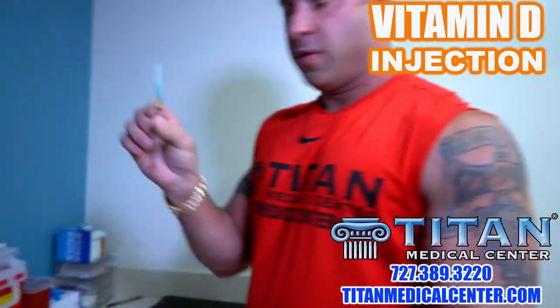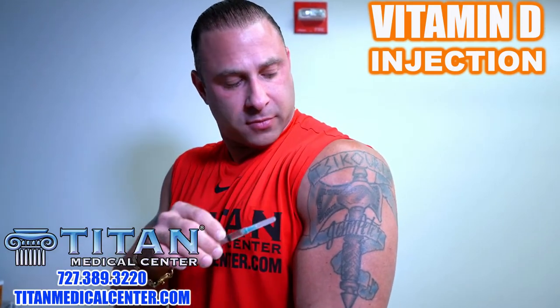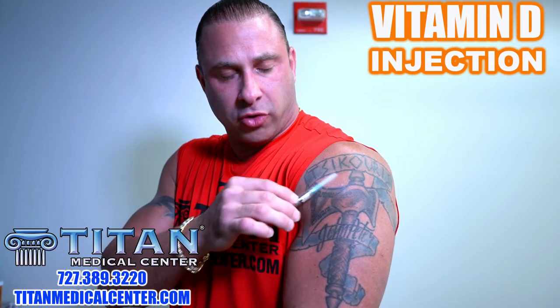Alright, vitamin D is ready to go. Now, where are we going to do the injection? Vitamin D is like any other injection — you can do it intramuscularly in any muscle. I'm going to hit right here in the shoulder, the center of the deltoid. The reason is that all the medication can disperse evenly through the muscle and get absorbed properly.